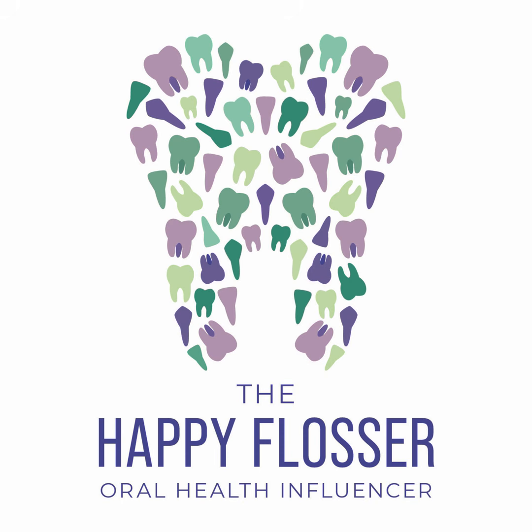One of the other most important things that you can do for your patient to achieve a successful set of images is to show empathy to your patient. Provide them with some encouraging words. Let them know they're doing a great job. Some patients have a really strong gag reflex or they have a really strong tongue. And sometimes just showing empathy to them will help calm them down just enough.